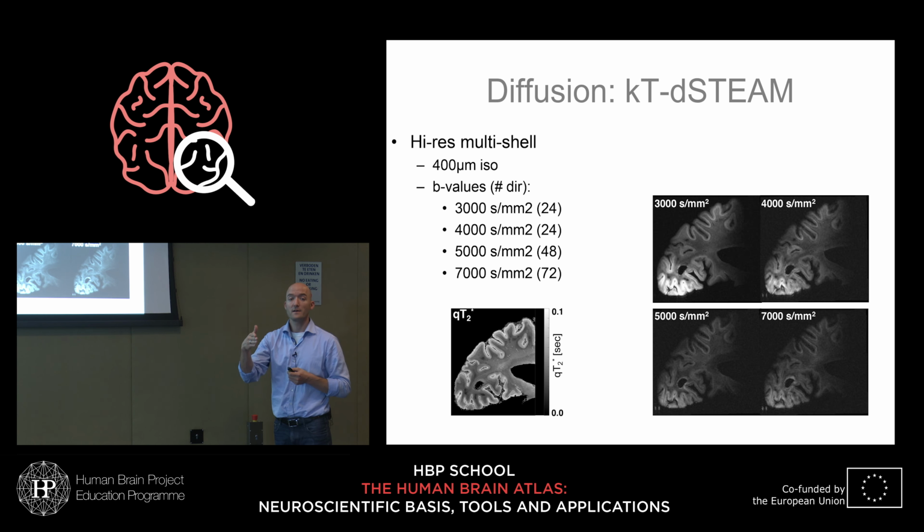Like, in this voxel, which runs in this direction, and this voxel that runs in this direction, can the diffusion signal tell us about the fact that it's more likely that here we have, I don't know, 1,000 axons per square micron? Well, per square 10 microns probably. And here we have more like 500 of them. So we do have that full resolution b-value trade-off over here.